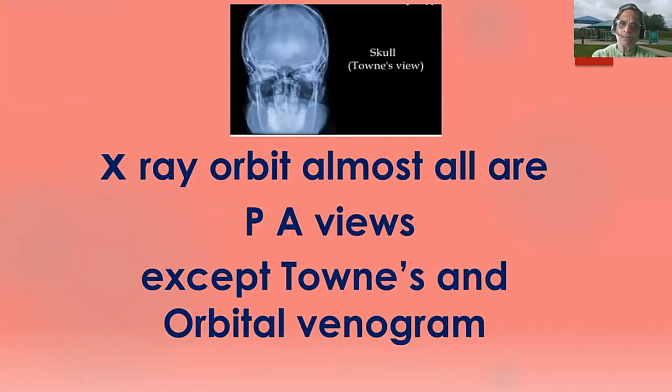I already told you, for X-ray of the orbit, almost all views are PA, except Townes and venogram. Just know that they may ask in the examinations, what is the role of the Townes view? Never forget that Townes view is used to visualize the inferior orbital fissure. That can be seen in Townes view clearly. That means if the problem is there, you can identify it. That's the most important thing.